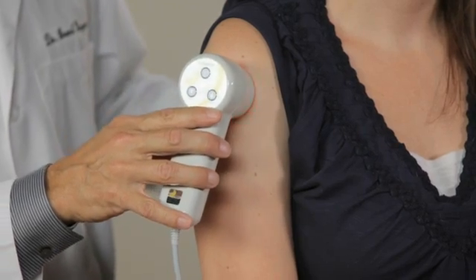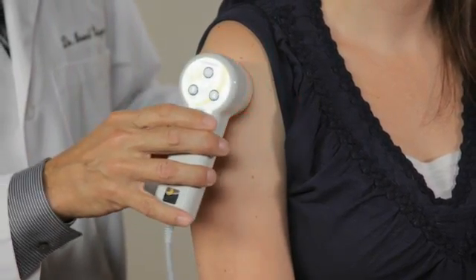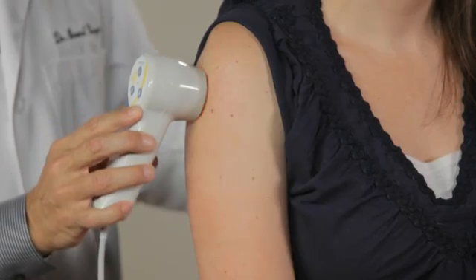As it is treating this area, you will use the timer on the base unit to treat the entire area with the laser stem. You will scan throughout the tissue and find multiple areas, and that is the uniqueness of this. After it has beeped and turned red, we reset it and continue to scan in various areas.